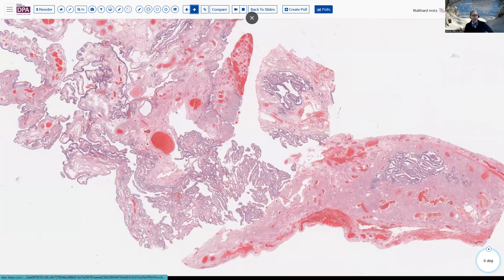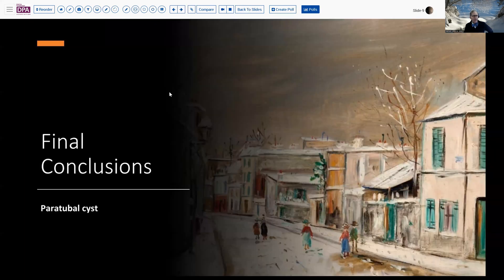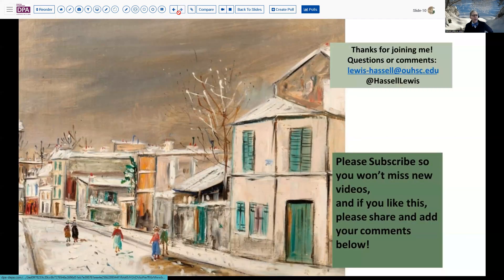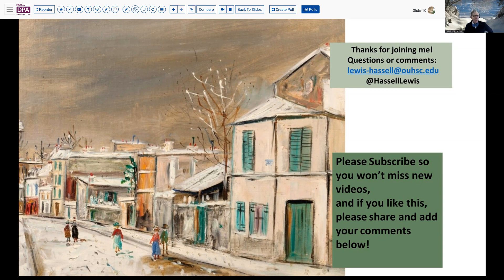That briefly runs us through the various types of paratubal cystic structures most frequently encountered — Mullerian, Wolfian, and Walthard-type epithelial and embryologic origins — but all probably safely grouped into the diagnostic category of paratubal cyst. Thank you for joining me. I hope that's a little bit helpful in understanding what you're seeing through the microscope. It's not rocket science or dramatic diagnostic gems, but it is helpful to understand the criteria used in differentiating these when they need to be differentiated, and it gives you something to talk about over the microscope with trainees.